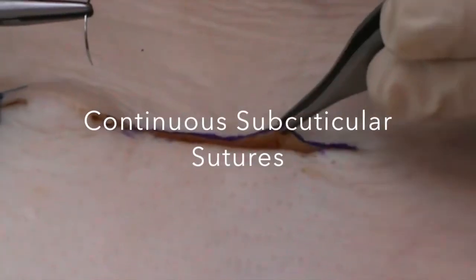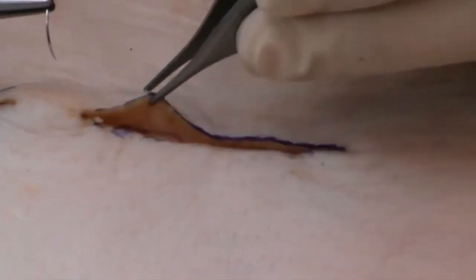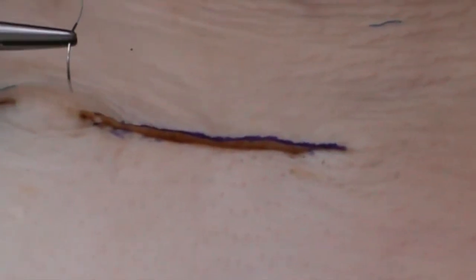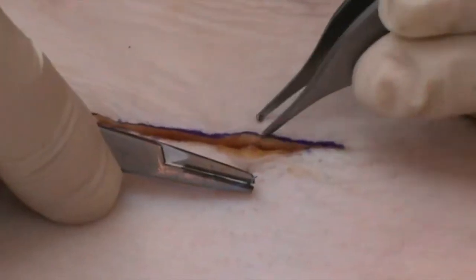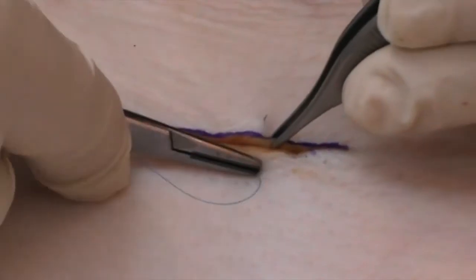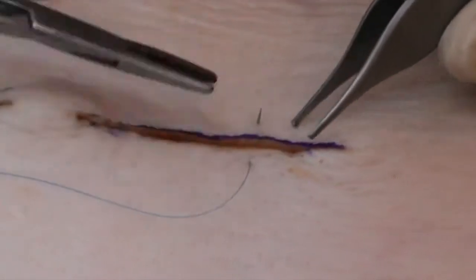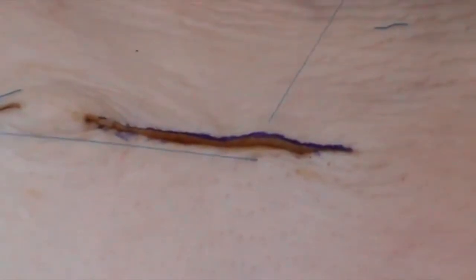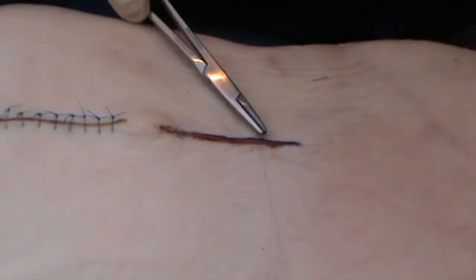This wound has now been closed with one, two deep sutures. I could put a third one in here, but you already get the idea that the wound is virtually closed. I could then, if I wish to, just put in some interrupted sutures. For instance, this is a 5-O-ethylon, which I could use as a much lighter, smaller calibre suture than on the previous excision.